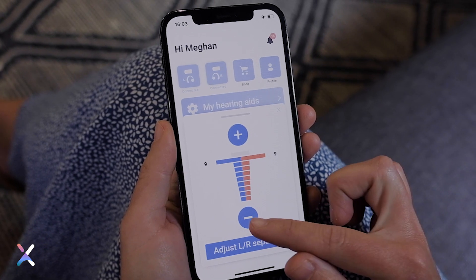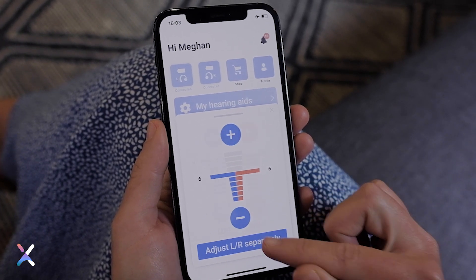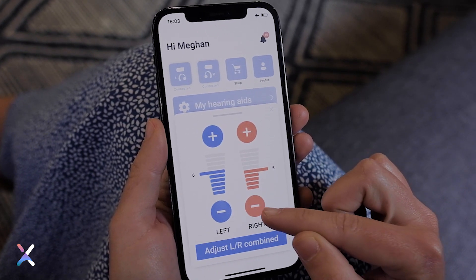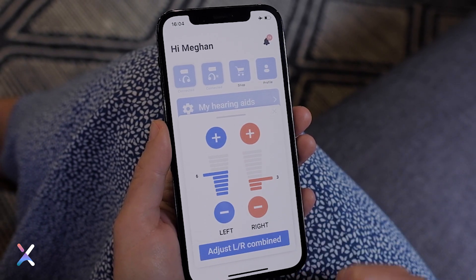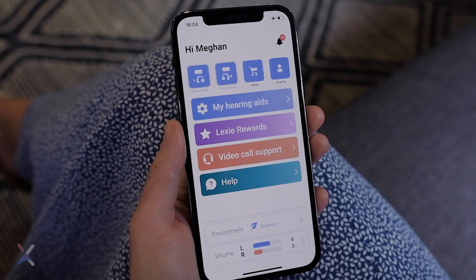Select how you want to adjust the volume. The volume can be adjusted together or separately. Use the plus and minus buttons to increase or decrease the volume. Close the volume screen to return to the main menu.